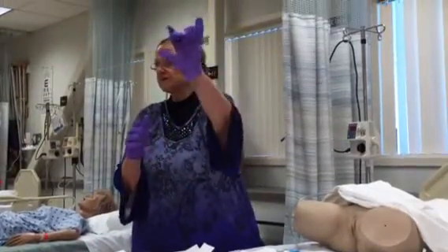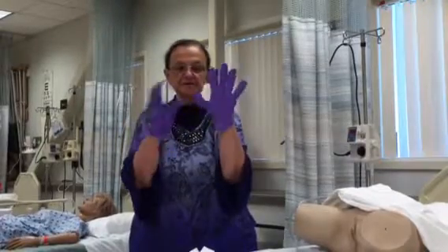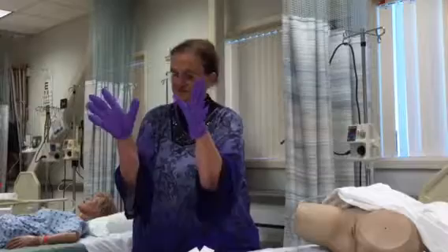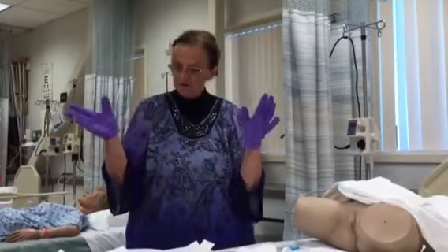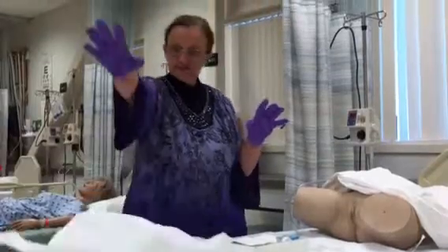Now, if you mess up like this, no issue, as long as you go sterile to sterile. Many of you with big hands will be glad to know these gloves are huge. The inside of this is still sterile, so I'm going to grab the inside and just get it out of my way.